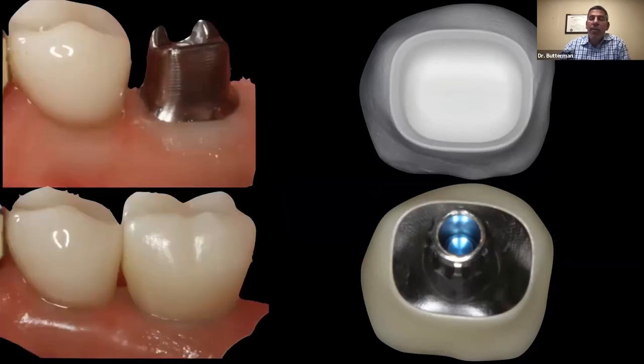It does a nice job of blocking out the titanium, and that can work quite well. So with Atlantis abutments, I've kind of shied away from glass ceramics, and my go-to is Katana, mainly for the fit. And again, I'm typically going to do this as a polish only type restoration. Okay, I'll shut up now.